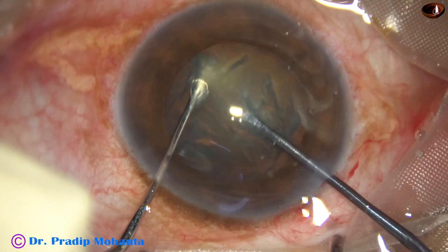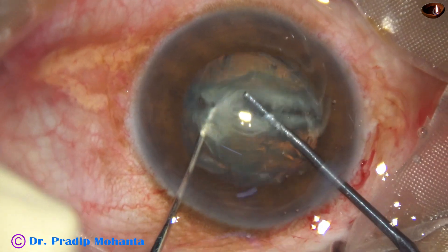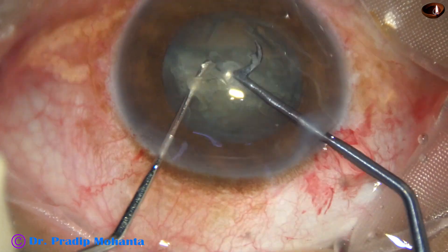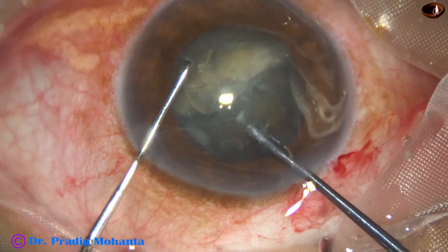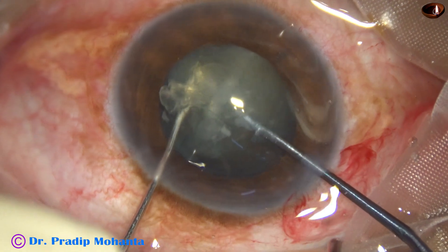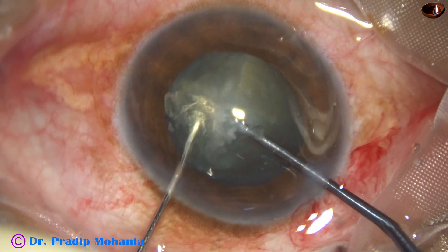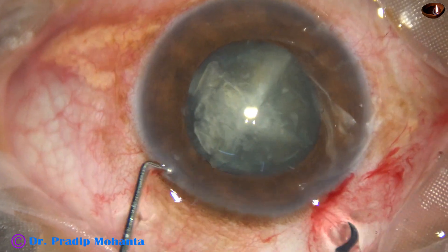On the left hand is a sustainer, a ball-tipped chopper. The two instruments come to each other and now rotate 90 degrees, place the pre-chopper again. The sustainer hooks the equator of the other hemi-nucleus and we get 4 pieces.